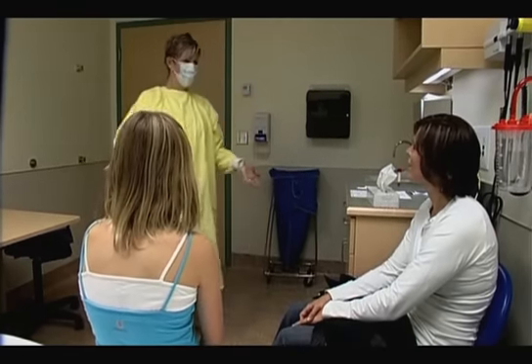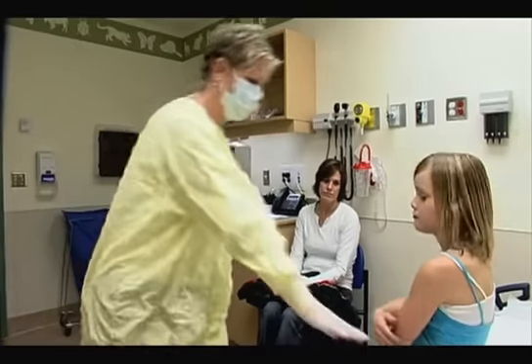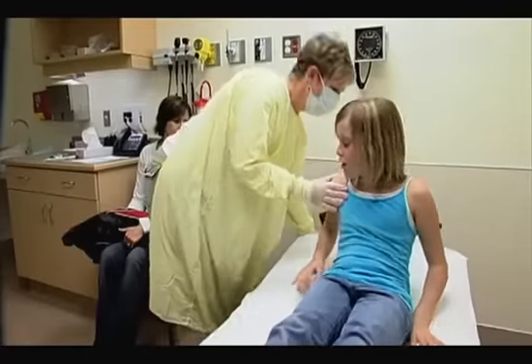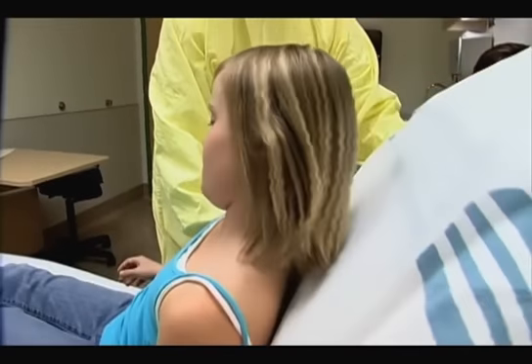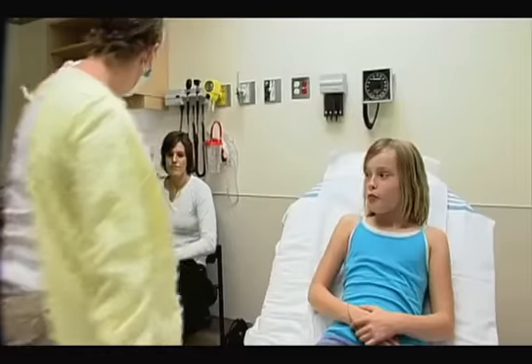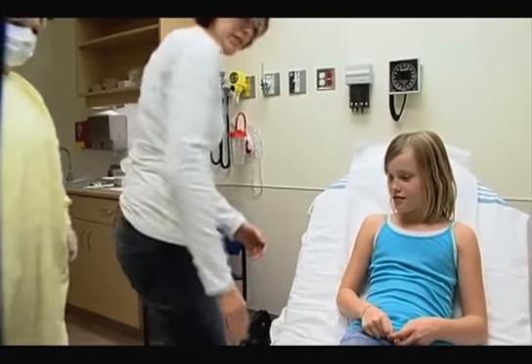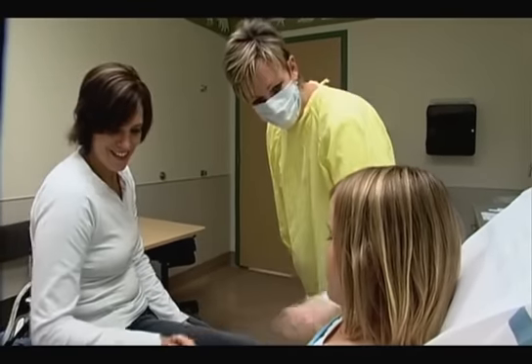Explain the collection procedure to the child and parent. Make the patient comfortable. Swing your legs around. Come back, and I'm going to put the head of your bed up. Alrighty. There you go. You want to come sit with her? Okay. And Mom can hold your hand if you need to, okay? Alrighty.